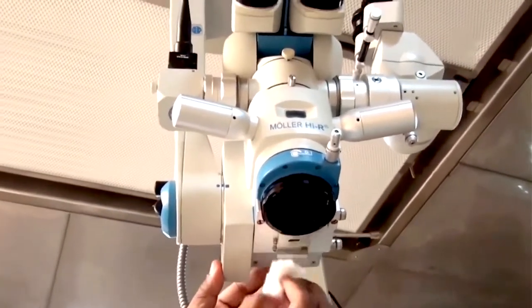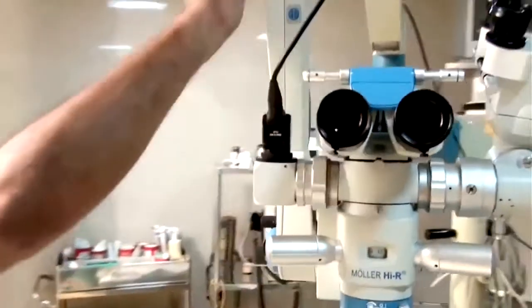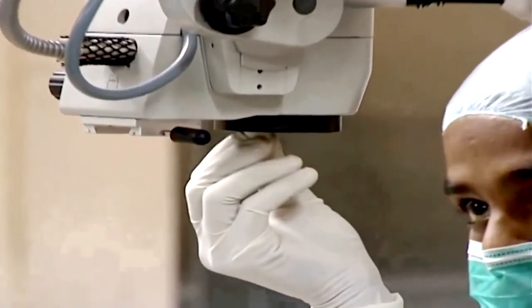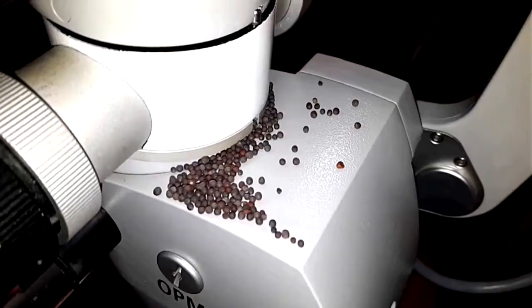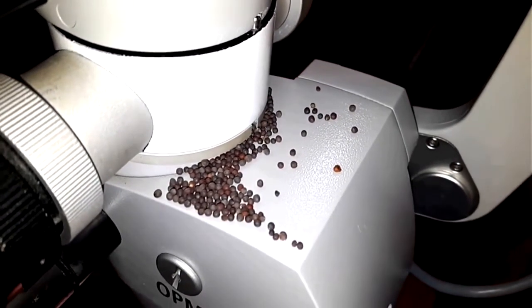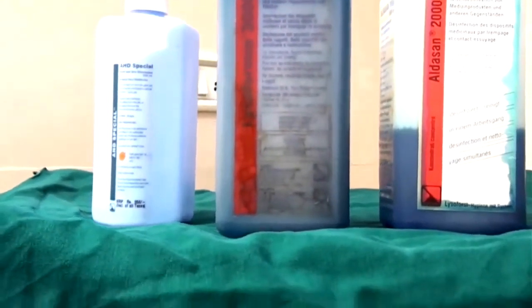The first thing you clean in the theater is the microscope. Whatever has settled onto the microscope is going to drop onto the surgical site. So that is the most important thing you have to do. Lens cleaning should be done with a different solution, lens cleaning solution, not with alcohol bleach. I'm demonstrating this with mustard seed on the microscope. When you zoom in, you can see the mustard falling down. The same thing is going to happen to the invisible deposits there.